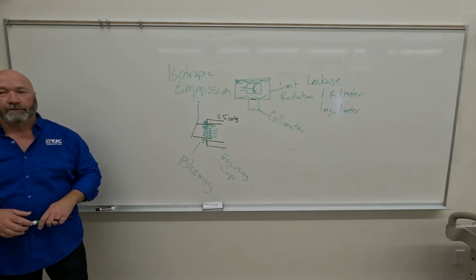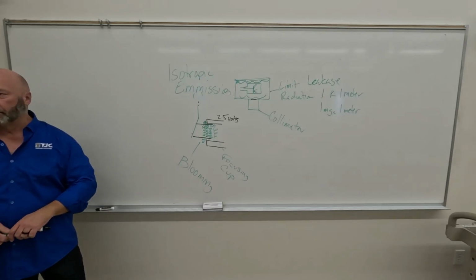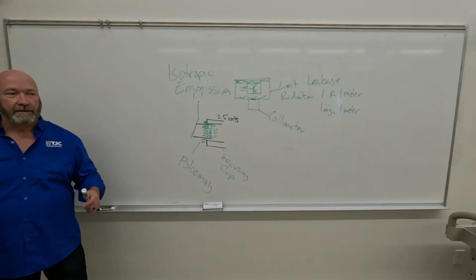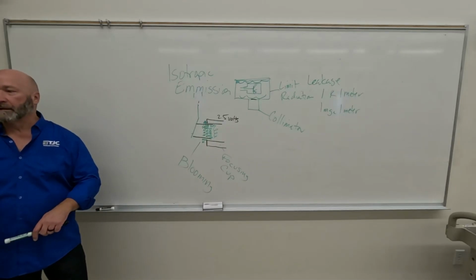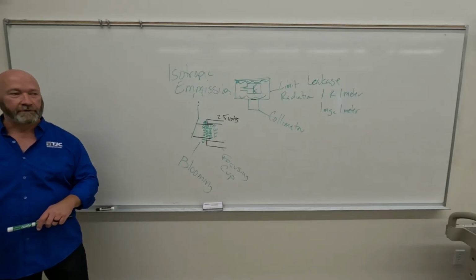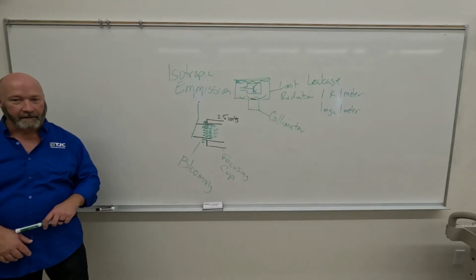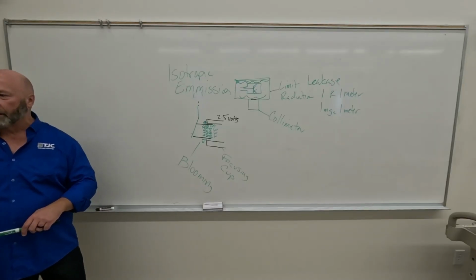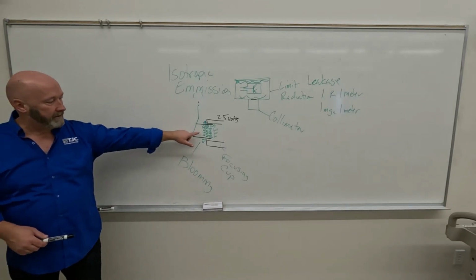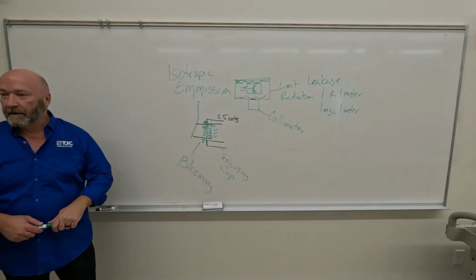So, you know, you walk into the room and somebody else is positioning, and you're watching the patient, and you start rotoring up. You're doing a chest X-ray, you start rotoring up before you tell them to take in a big deep breath. So what's your second instruction to the patient after a big deep breath? Breathe. Blow it all the way out, taking another deep breath, you're still rotoring up. You're creating a ton of heat. With a ton of heat, you're creating a big space charge, right?